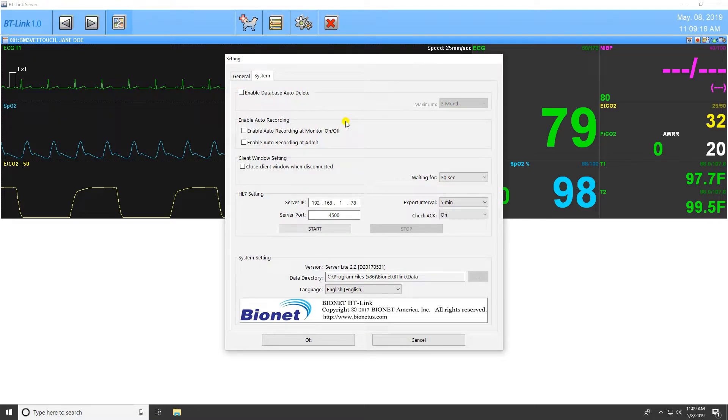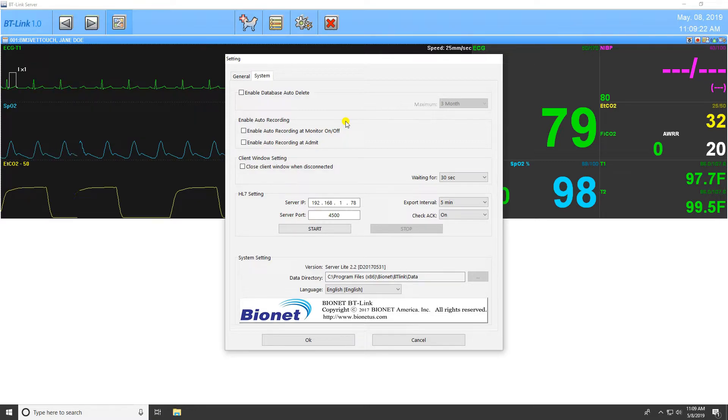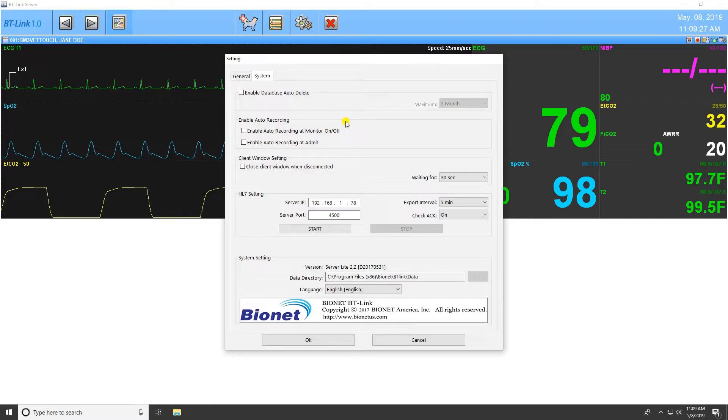Following this are the Automatic Recording settings. These options allow the program to automatically record data when the patient monitor is turned on or when a patient is admitted into the program.